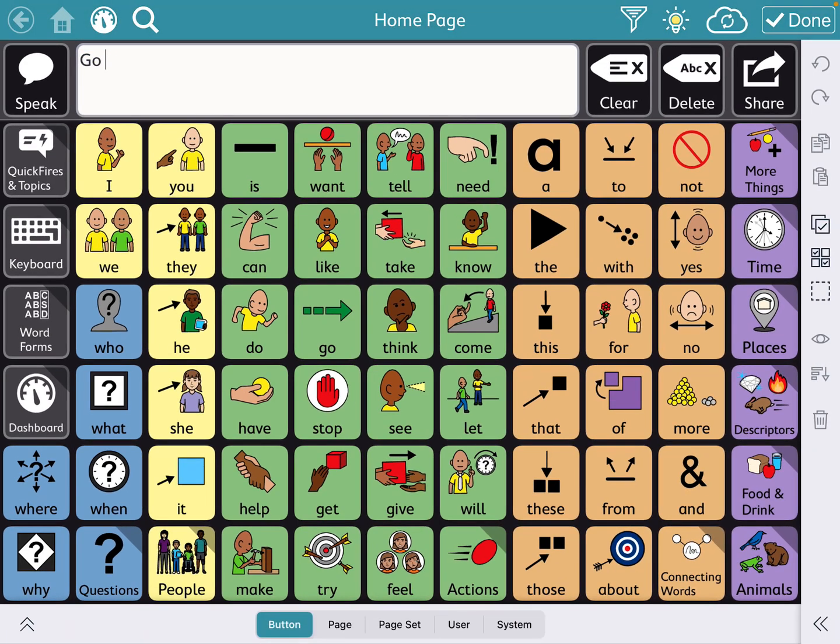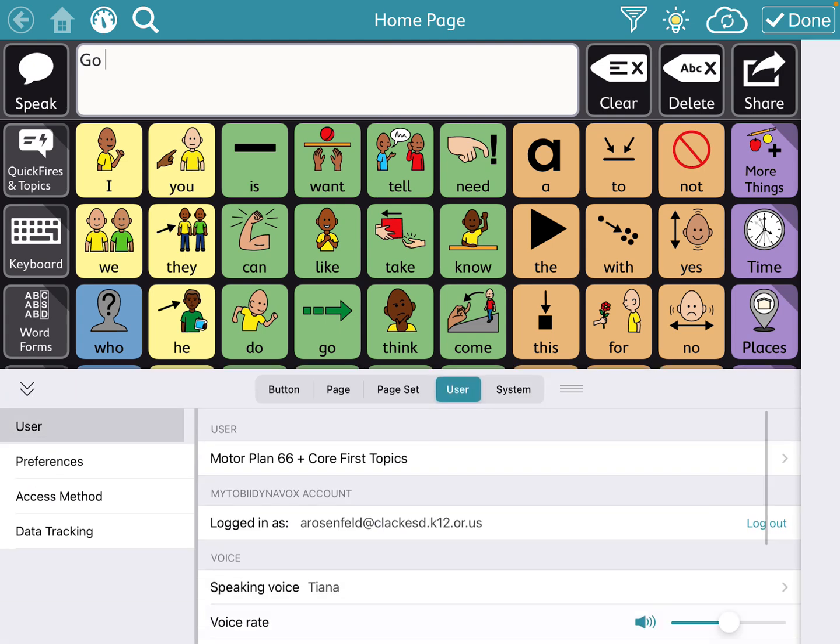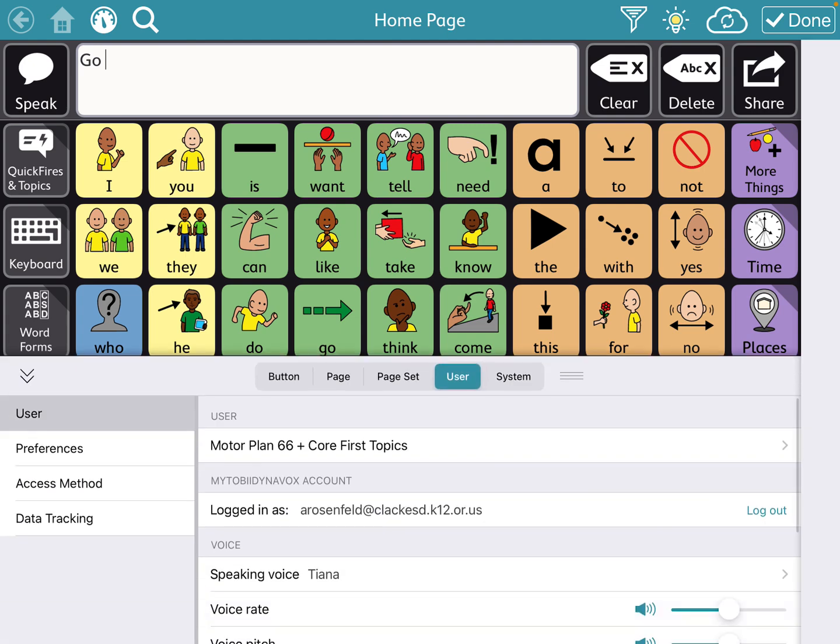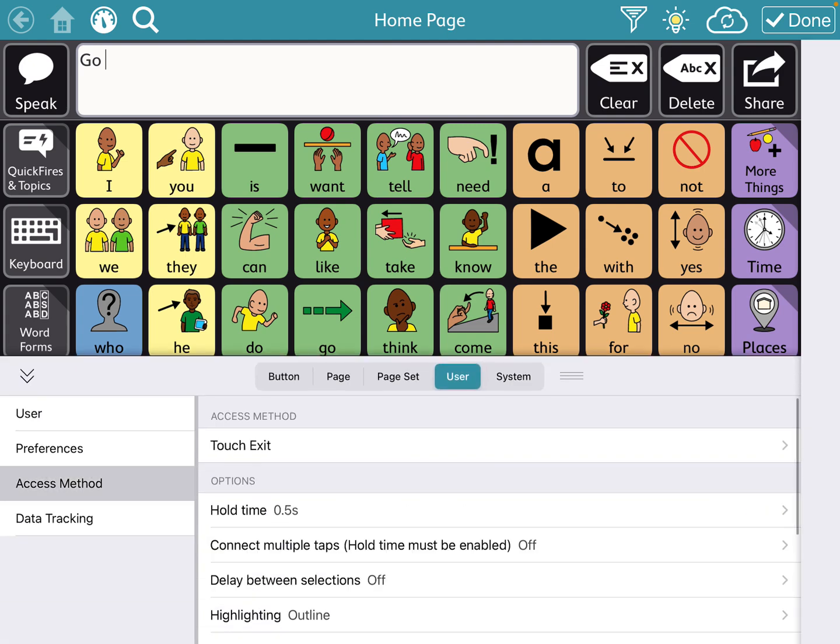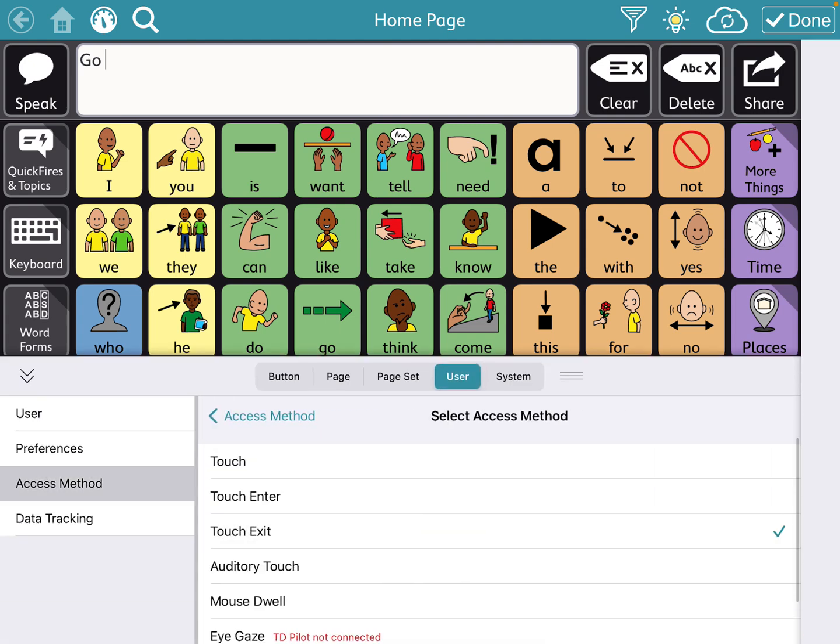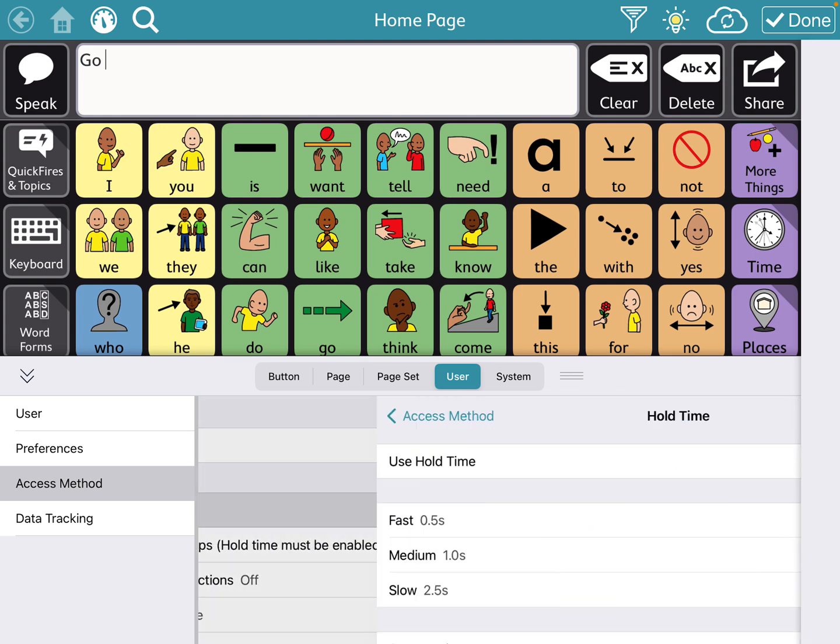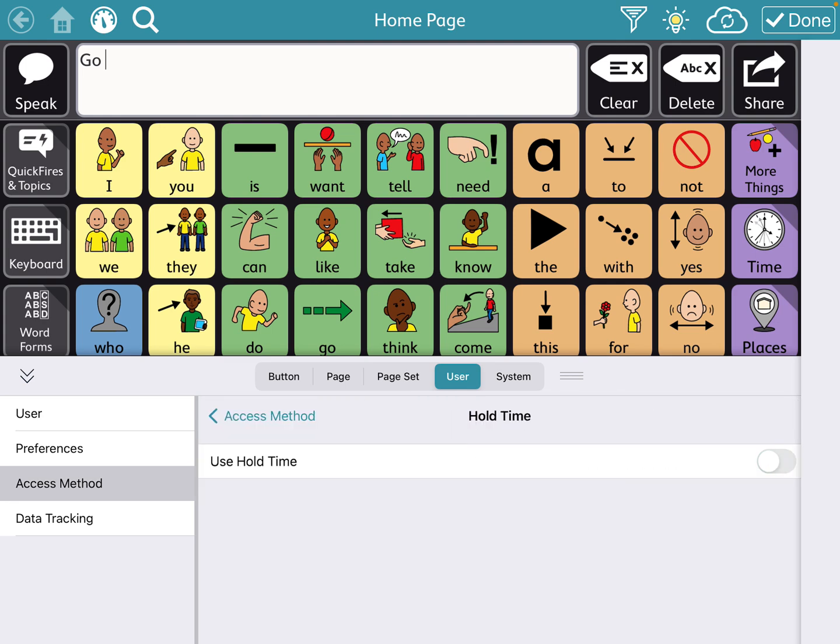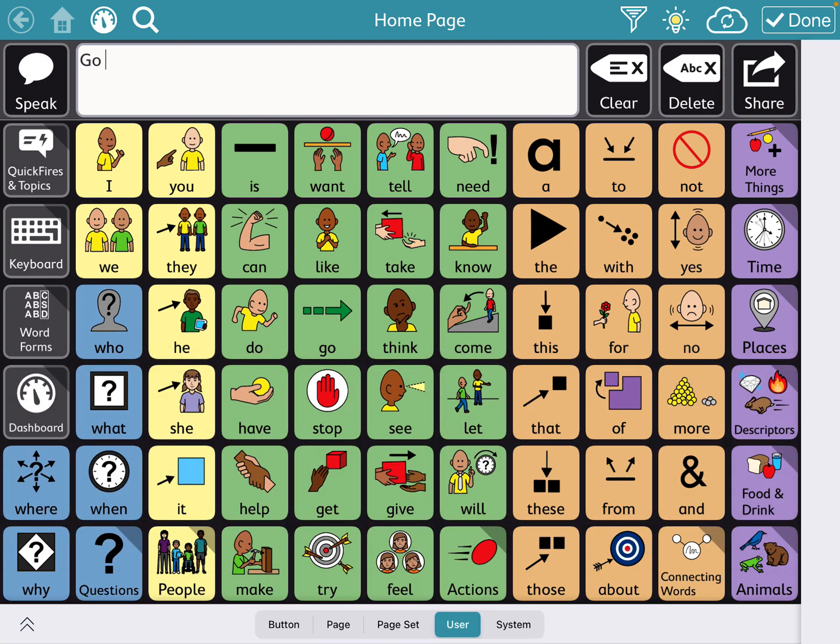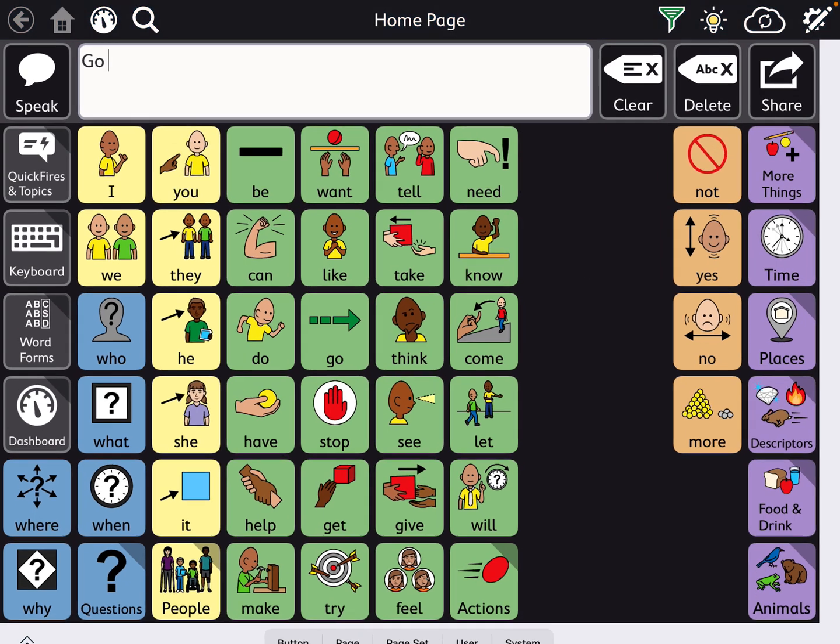And so now I'm going to turn this off and you'll see what it's like without that. Oops, forgot to get out of editing mode.